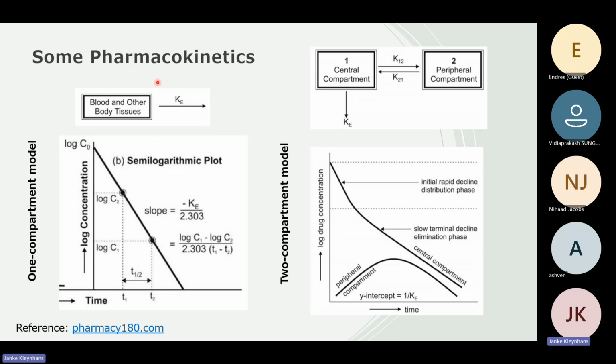From that you can take blood samples, measure what is excreted, and also use imaging to plot the kidney function, and then you know if there is obstruction or any malfunction of the kidneys. The ideal GFR agent, of course, will be a one compartmental model without any other surprises.